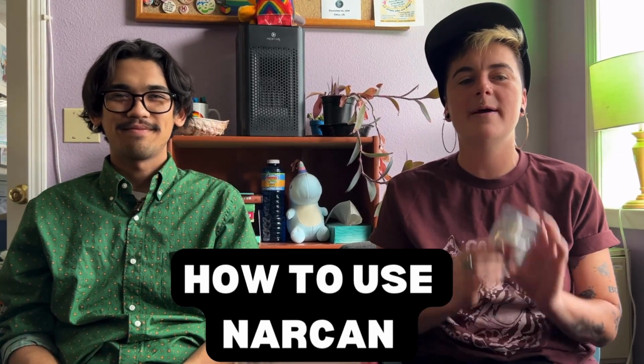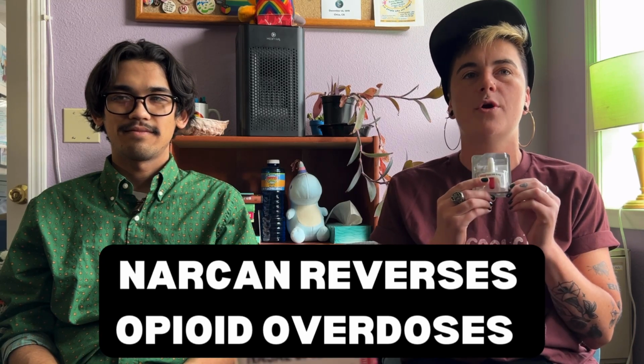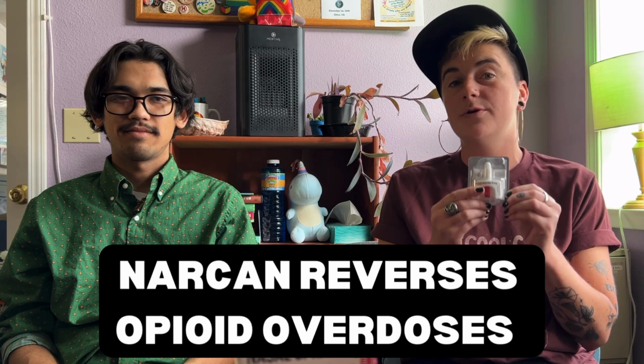Today we're going to talk to you about Narcan and how to use it. Narcan is used to reverse opioid overdoses and opioid overdoses only.